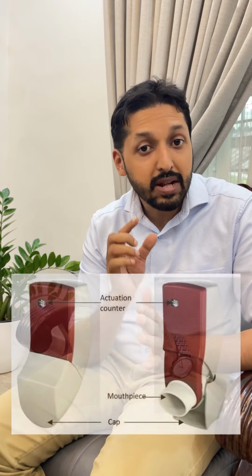See, there are different types of inhaler. One is a pressurized metered dose inhaler, then MDI with spacer. Then comes the breath actuated metered dose inhaler. Then comes the dry powder inhaler, nebulizer, soft mist inhaler.